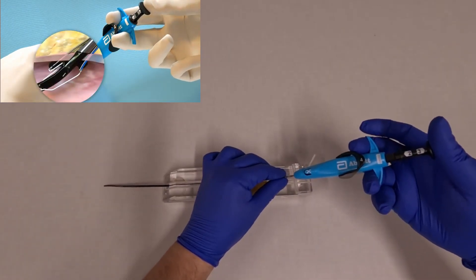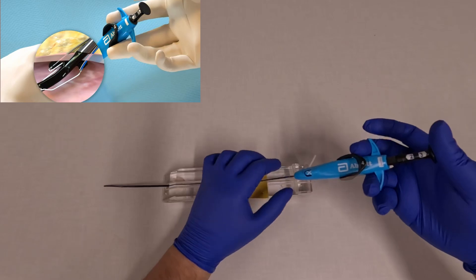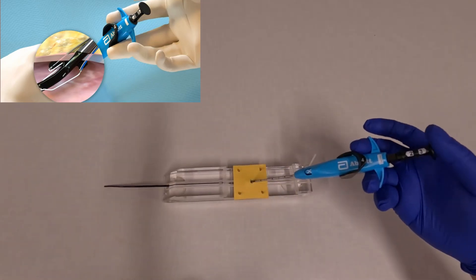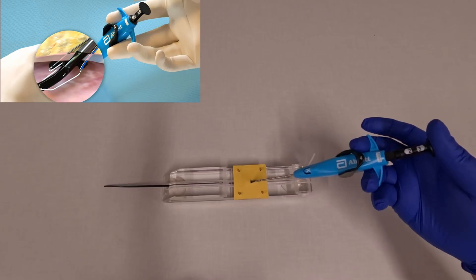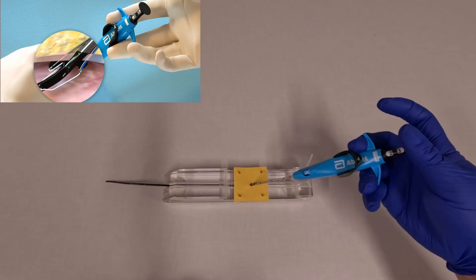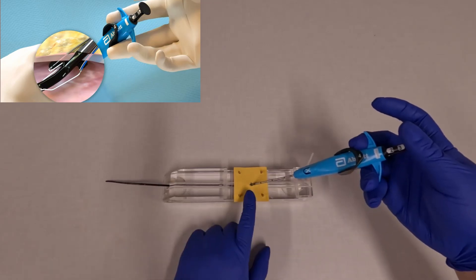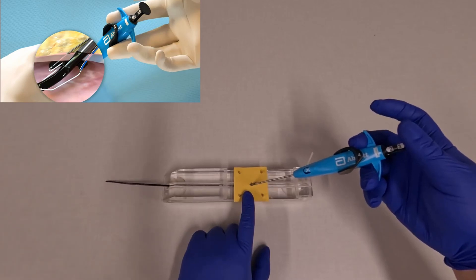Now stabilize the device with your left hand and use your right hand at the top of the device. Step two deploys the needles that drive the suture into the arteriotomy. You need a fairly good grip and then you're going to push firmly with your thumb to deploy the sutures. The sutures deploy down toward the footplate.